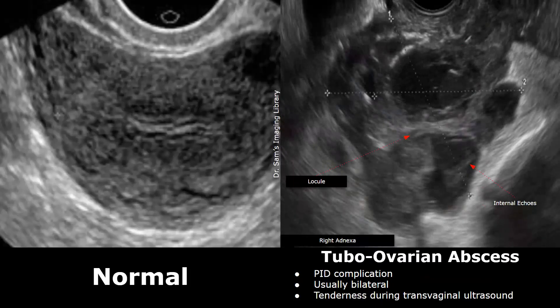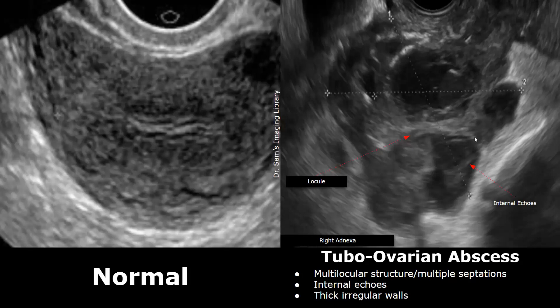A tubo-ovarian abscess is a serious PID complication. It will be present in patients with any untreated pelvic infection. It is often bilateral, but it can be unilateral. The patient can have tenderness during a transvaginal ultrasound scan. On ultrasound, a tubo-ovarian abscess appears as a hypoechoic structure with internal echoes and multiple locules in the adnexa, usually on both left and right sides, but it can be unilateral. A locule is a compartment or a chamber.